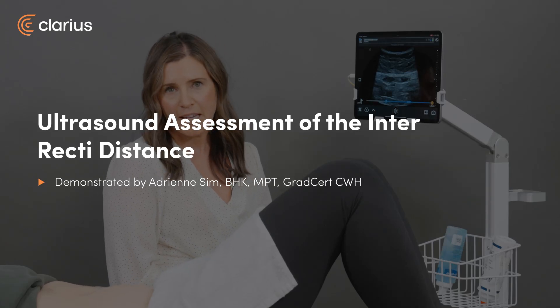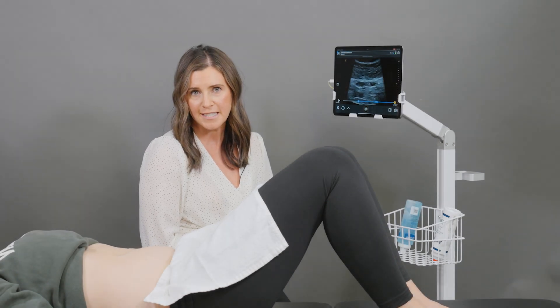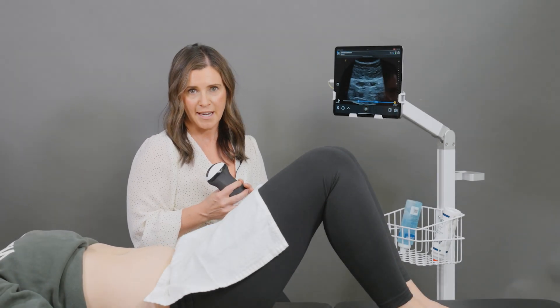Hi, my name is Adrienne Sim, and today in this video we're going to be looking at a transabdominal approach to looking at the interrecti distance with the C3 scanner.